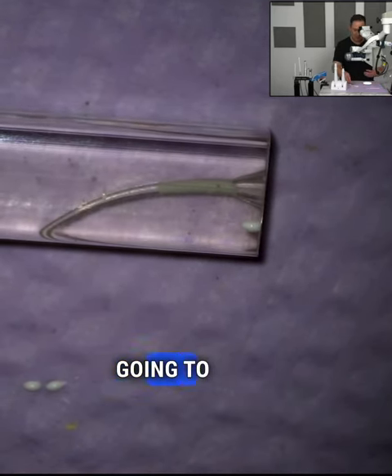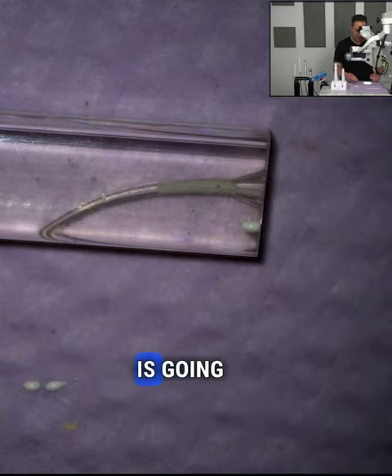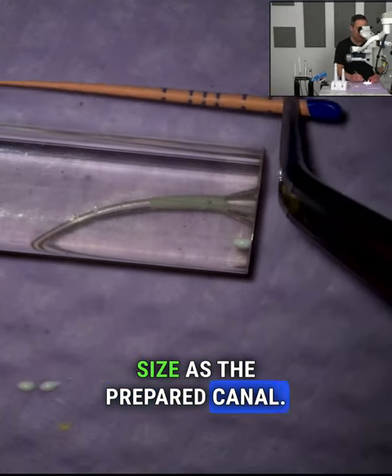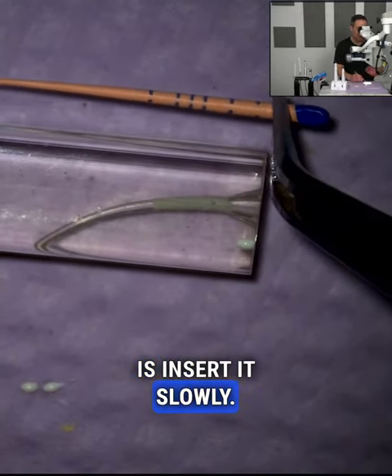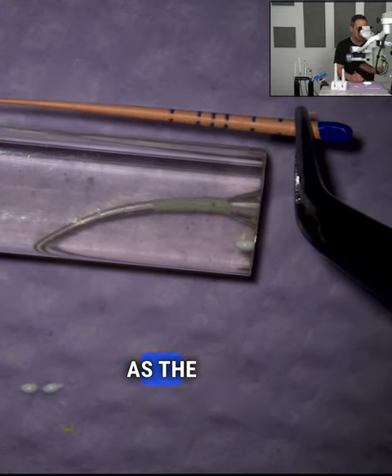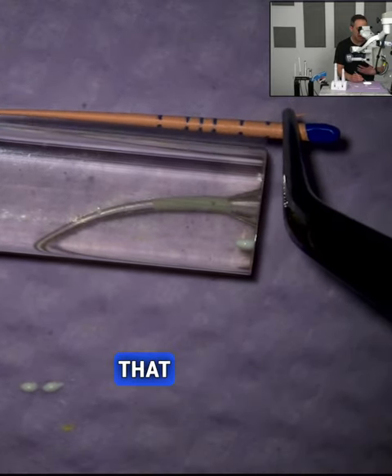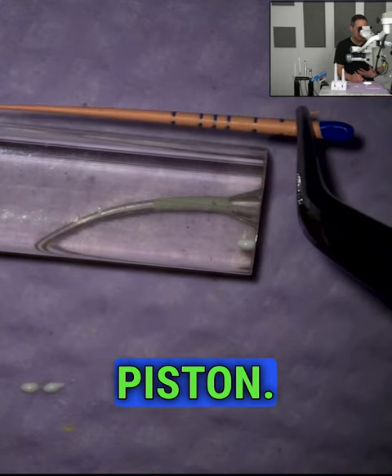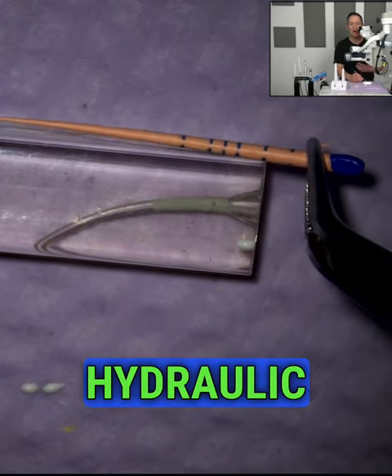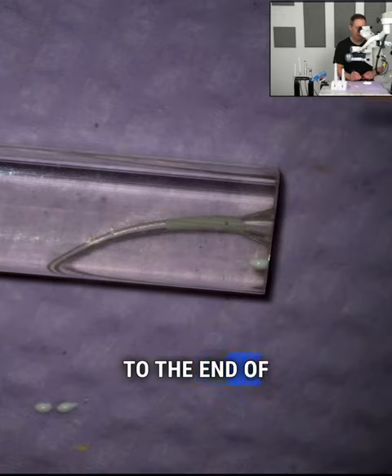Now we're going to bring in our match cone. The cone is going to be the same size as the prepared canal. We're going to insert it slowly. As you'll see, as the tip of the cone goes into the sealer, it's going to serve as a piston. In essence, a hydraulic piston to carry the sealer to the end of the root. So watch how it works.